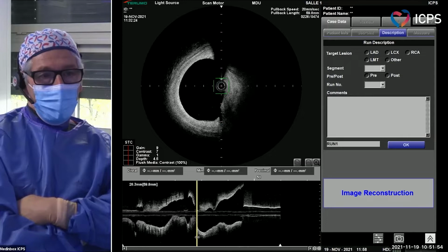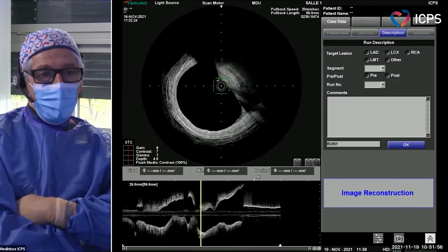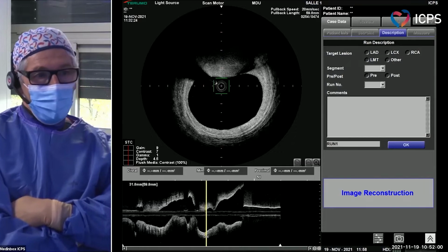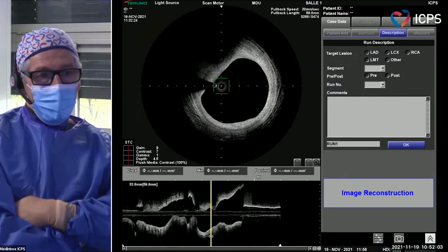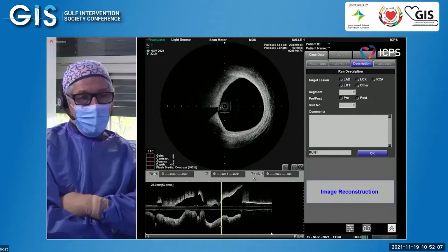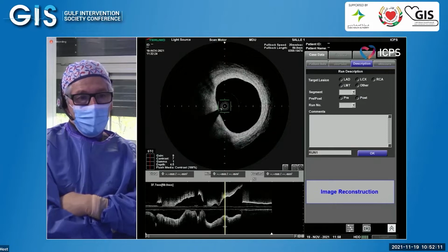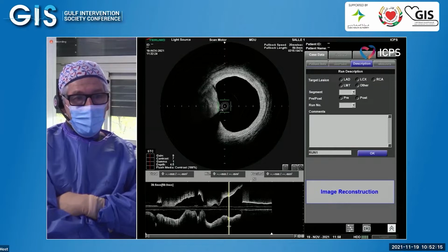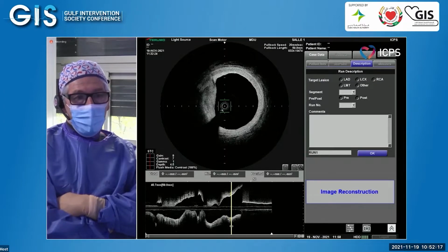Continue. And now you see there is disease in the left main, clearly. Sherry, I think everybody agrees that there's disease, but does that mean it needs a stent? I mean, if FFR in the circumflex would be normal, then you could consider to just treat the LAD.